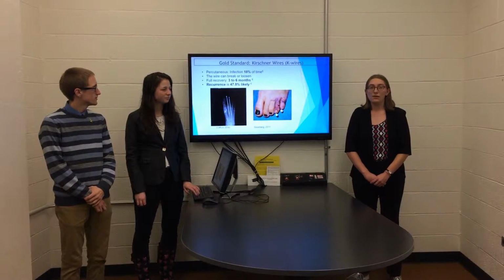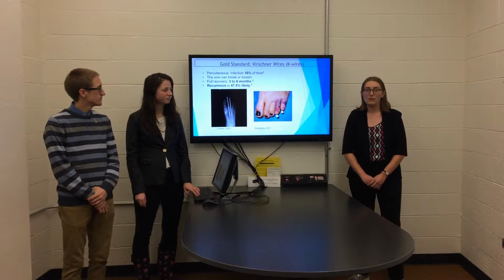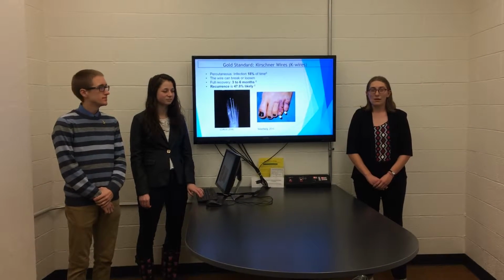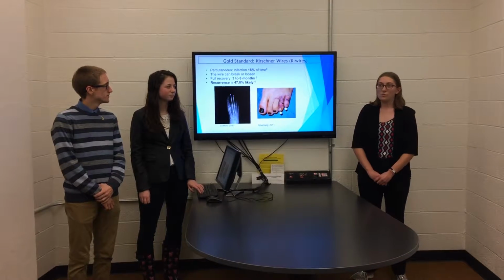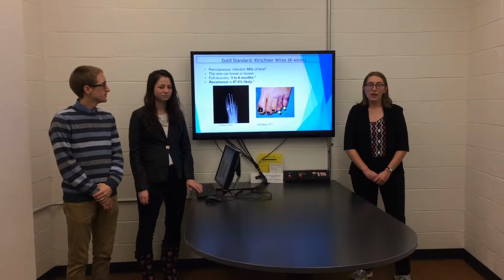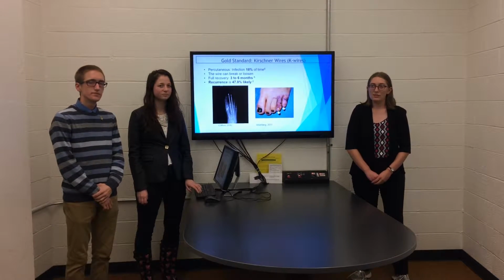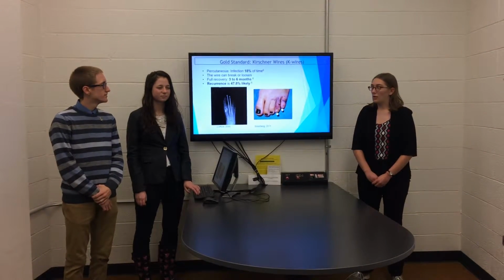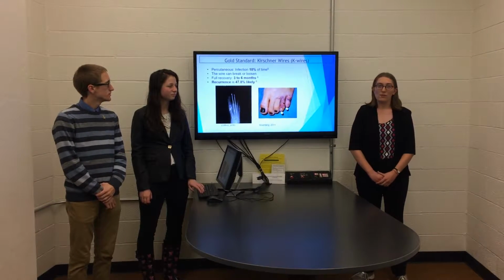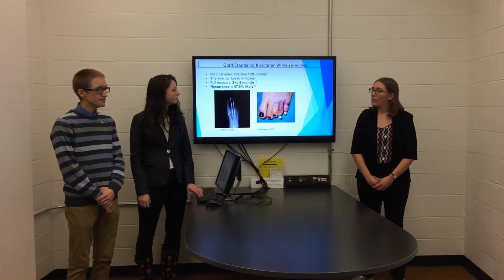The current gold standard for the treatment of this deformity is the Kirschner wire, which uses an arthrodesis PIP procedure, which is the removal of the bone from each side of the PIP joint, and then the insertion of a 4-inch stainless steel wire through the end of the toe, as can be seen in the image on the right, and the x-ray of this wire can be seen in the image on the left.